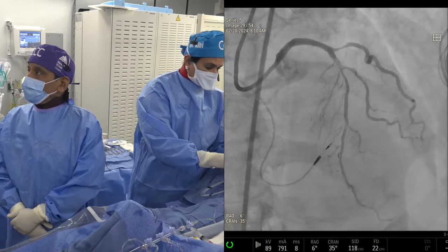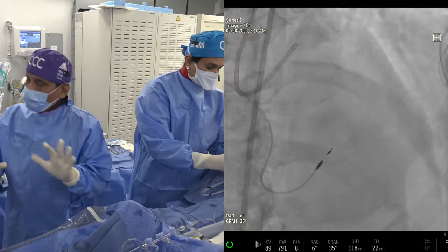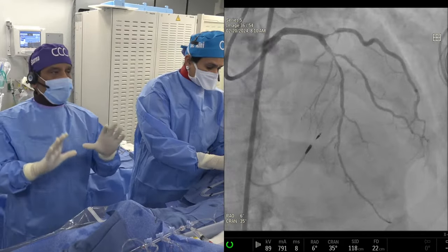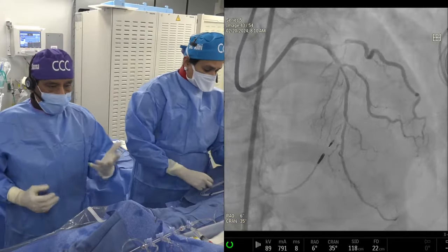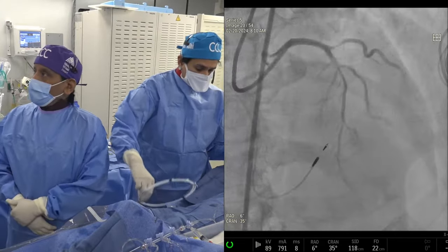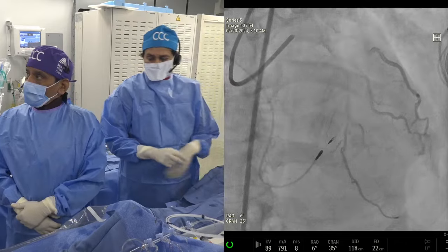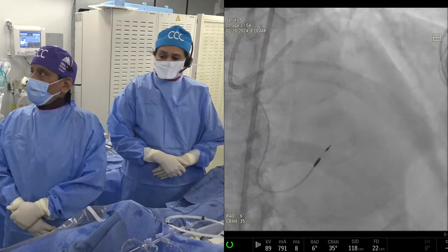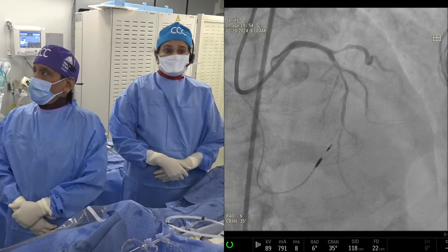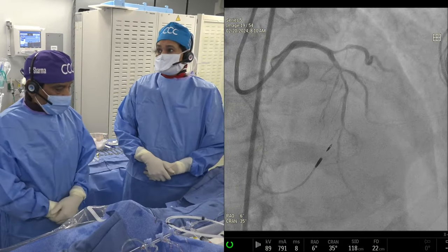Then there is additional lesion in the mid to distal LAD. Our goal is to leave that alone. Just take care of the proximal LAD with the two diagonal origin. And this is what we wanted to talk about today, how we are going to deal with it. The second question is, do we need any atheroablative strategy? Although angiographically, if I had to grade it, I would read it as a moderate calcium. So what is the strategy?